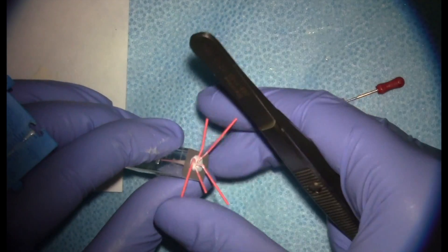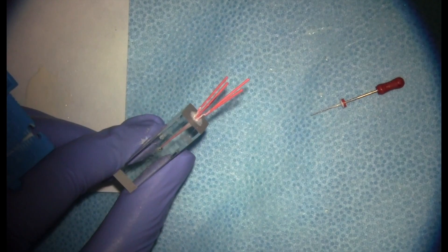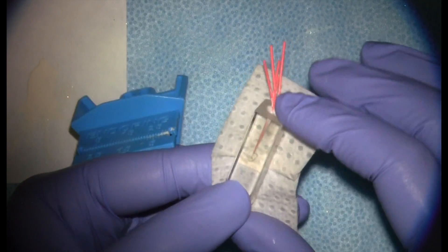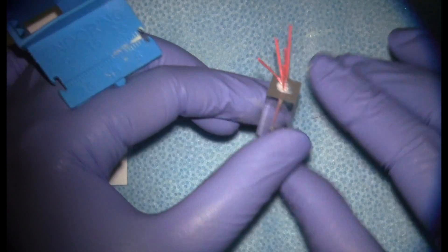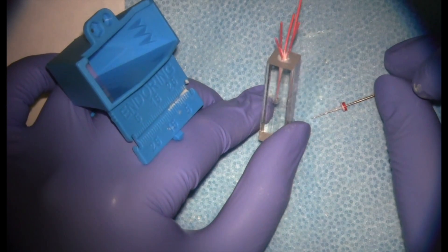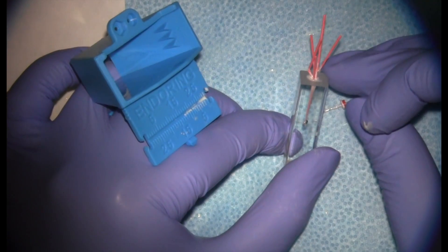You're going to work until your spreader won't go beyond the coronal third of the canal — in most teeth that means your spreader won't get beyond about 10 to 12 millimeters. Usually it takes about four or five accessory points, but in larger canals you can have several more. Basically, once you can't get your spreader beyond the coronal third, you're likely sealed apically and coronally.